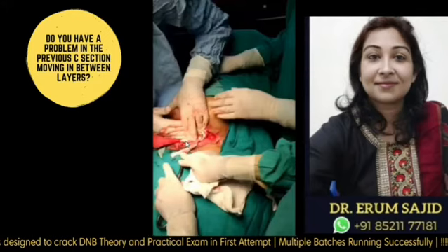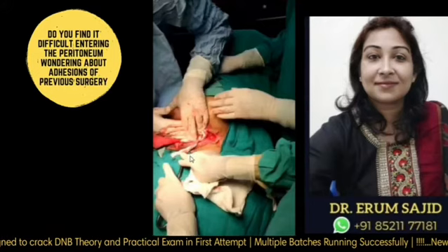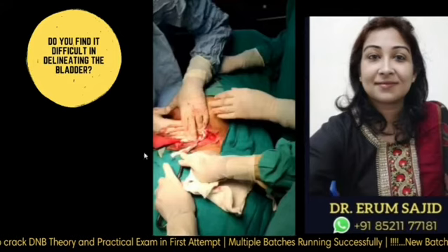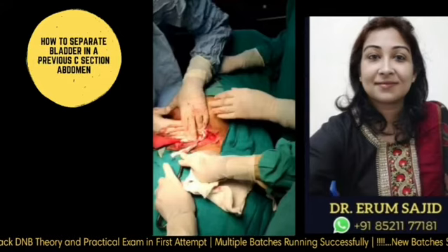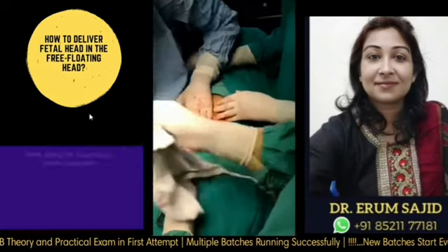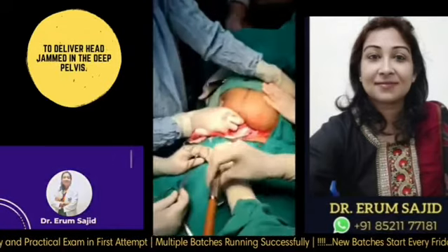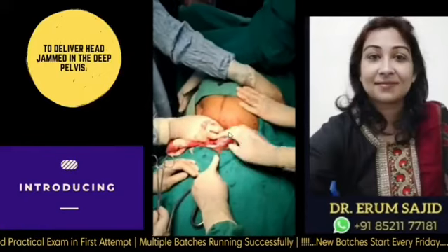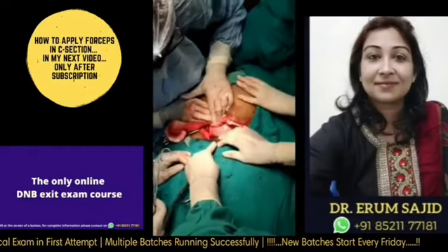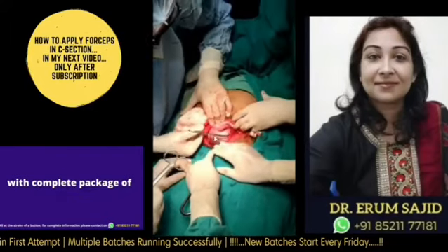Then I'll pull up the uterus, and since I've pulled up the uterus, I can't go very low in giving the incision now. Okay, so I'll pull up the uterus, I'll try to nick the UV fold, put it down, and then give an incision in the UV fold. So I'm in the lower segment. So I start here. I'm asking my assistant to stabilize the uterus. She has stabilized the uterus, and now my attention will go on the lower segment. See, this is called pulling the uterus, the lower segment above. So automatically I'm now searching for the UV fold.